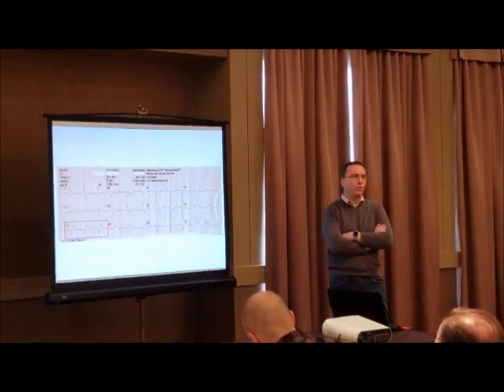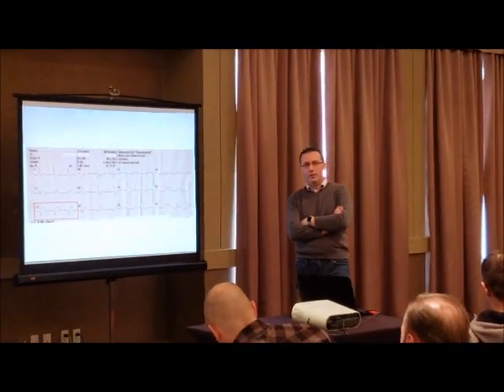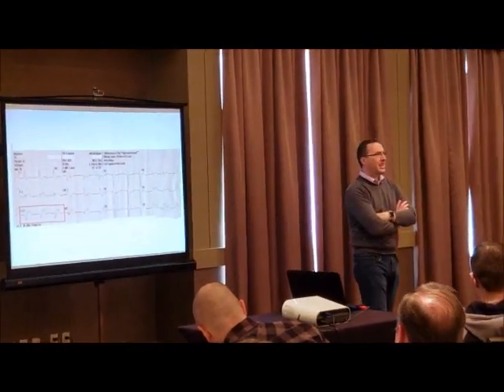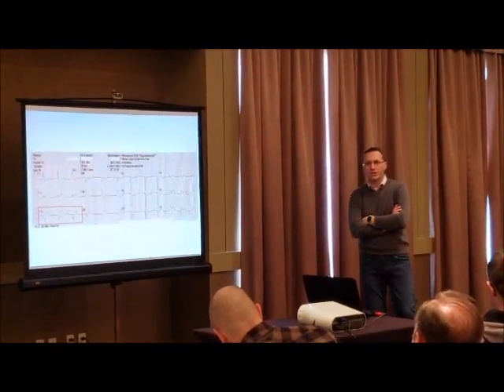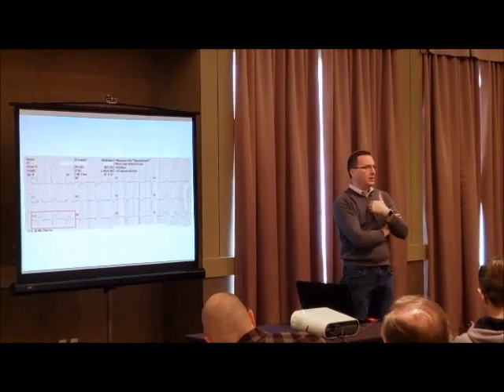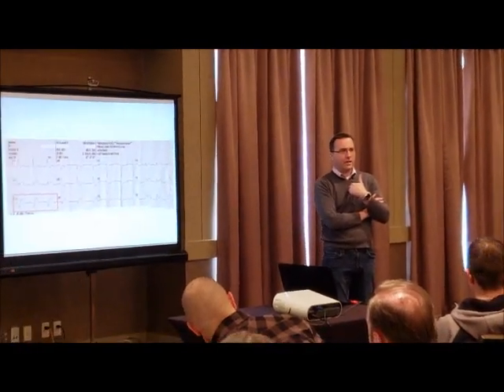But that's okay, because someone came along and modified Sgarbossa's third criteria. This is sometimes referred to as Smith's modification of Sgarbossa's criteria. And he introduced the rule of proportionality to that third criteria. And it's basically, is there excessive discordance? Is there ST segment elevation that is at least 25% the depth of the S wave? Now, for my liking, this is still too complicated for field use, because now you're still expected to do math.